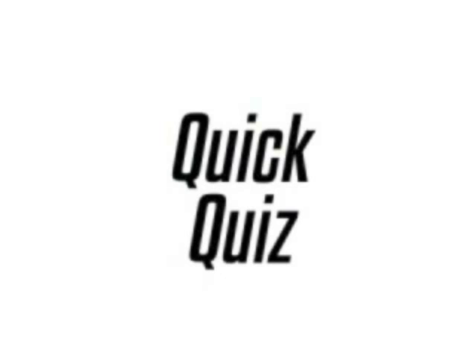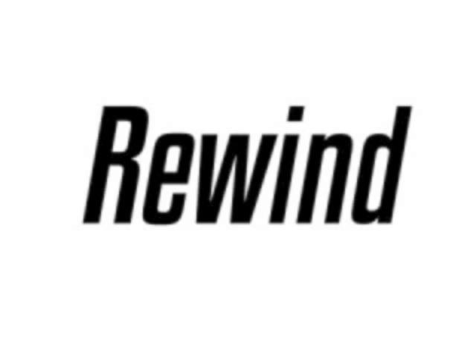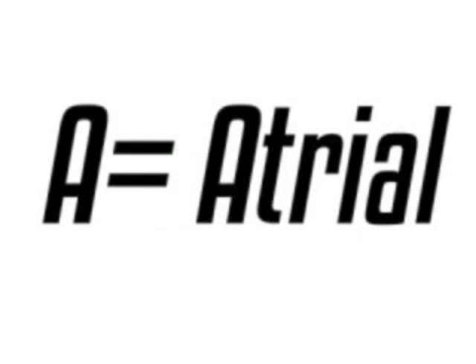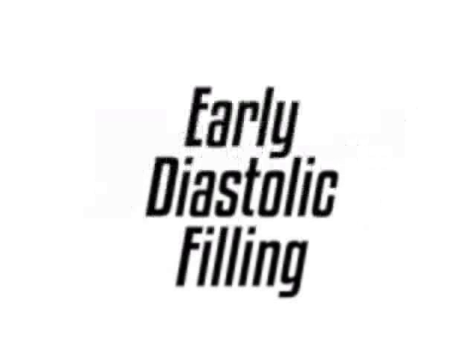Okay, quick quiz. If you don't understand these concepts and answer these questions correctly, then you are not allowed to go on. You have to go back, listen again. So, first up, what does the E and the A stand for, and what do those waves represent? So, E stands for early, right? What does the A stand for? Atrial. And so, therefore, what do the waves represent? Well, the E wave represents early diastolic filling, and the A represents the atrial kick, that part of diastolic filling.